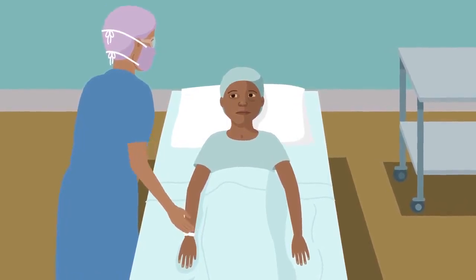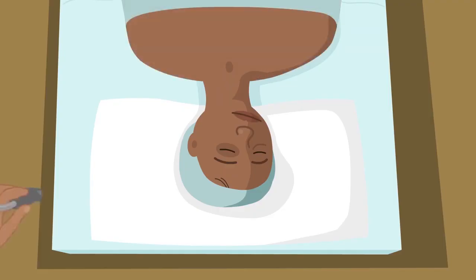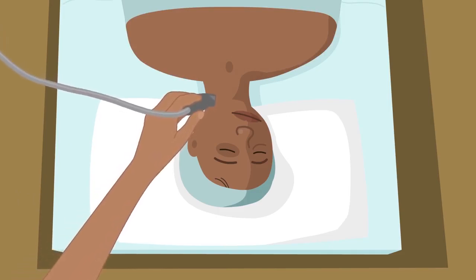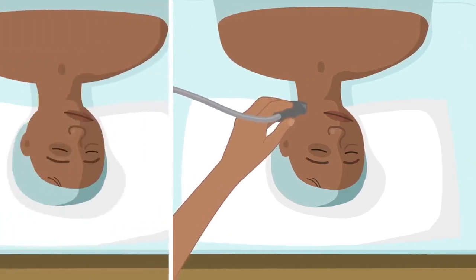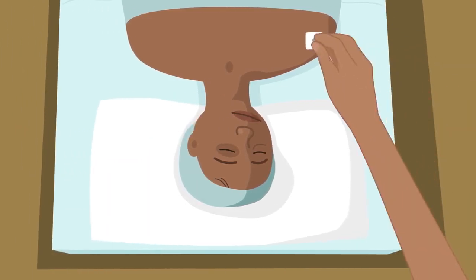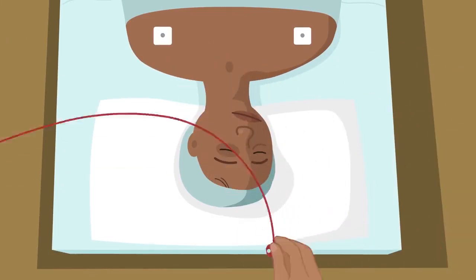Place the patient in the supine position with the arms alongside the body. The physician locates the anatomical structures by using ultrasound or, if unavailable, the landmark technique — between the two heads of the sternocleidomastoid muscle — and marks the site for insertion. Monitoring devices are installed: ECG, pulse oximeter, and blood pressure cuff.